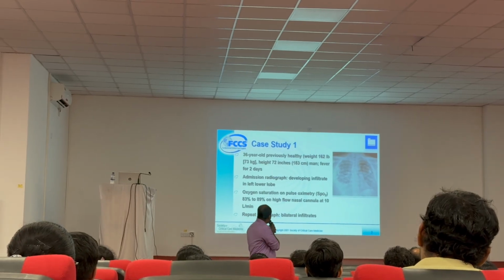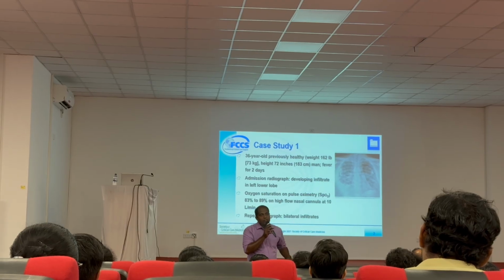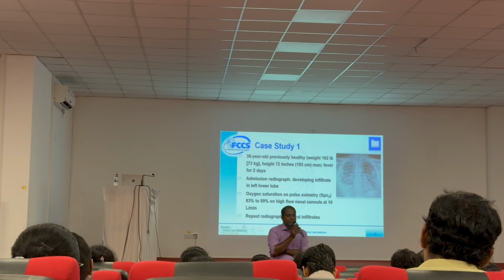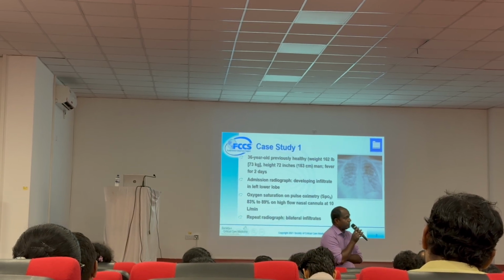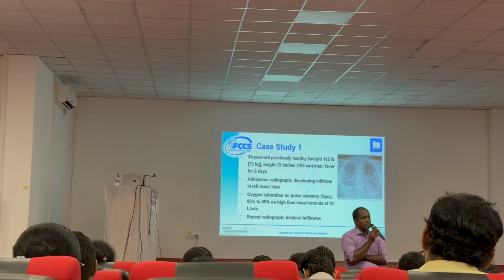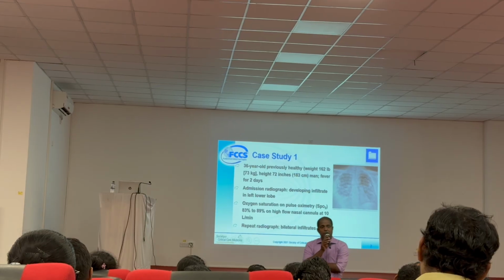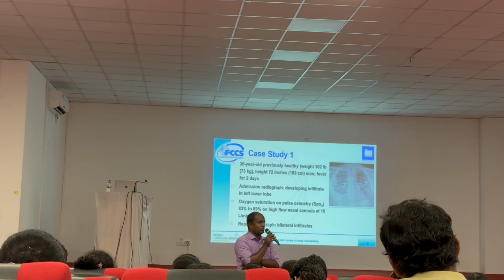The first case is difficult to ventilate. When the patient comes, you put the patient on mechanical ventilation. What is our primary aim in doing mechanical ventilation? What are the things we are doing with the mechanical ventilator? We are doing oxygenation and ventilation. That's basically two things.